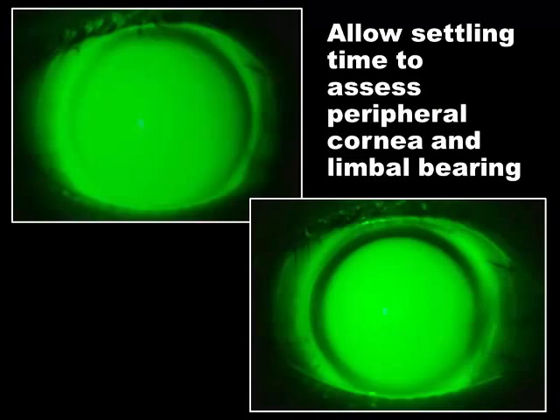Now, it's very common to see this kind of appearance after settling, where you have this nasal superior arc. And we'll talk about this. It has more to do with the slight temporal decentration of the lenses. But on insertion, when you can see an identifiable ring going almost 360 degrees around, that tells you that after settling, there's a real good chance that lens is just going to sink into touch, if not 100% of the way around, a good portion thereof.